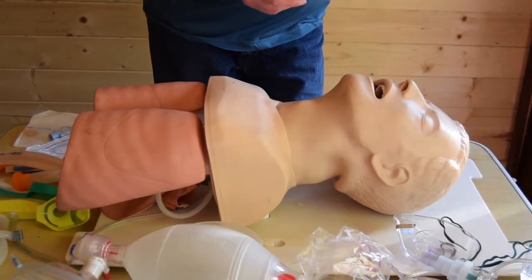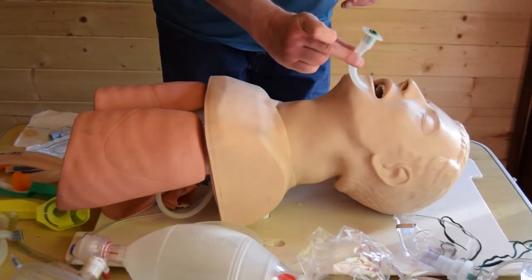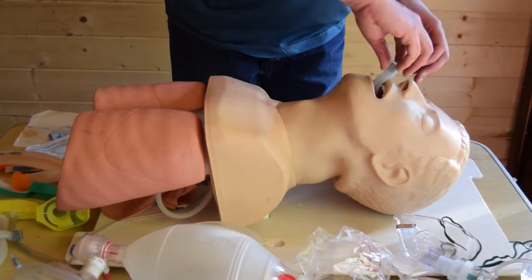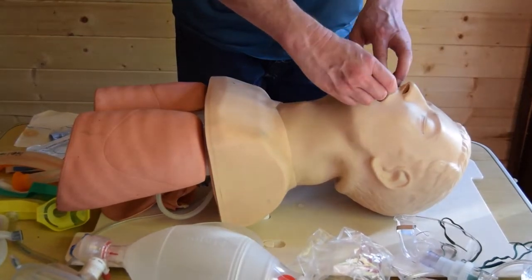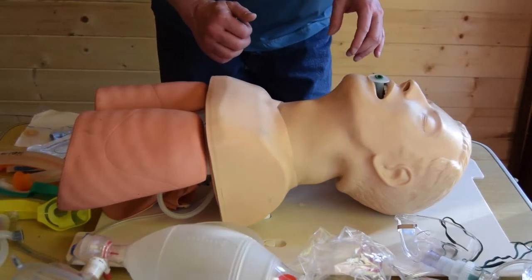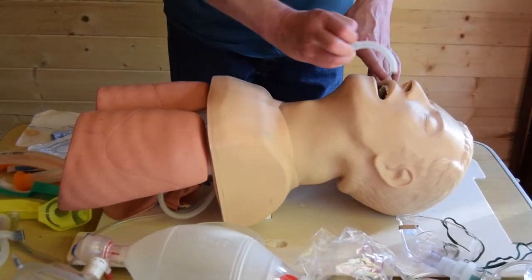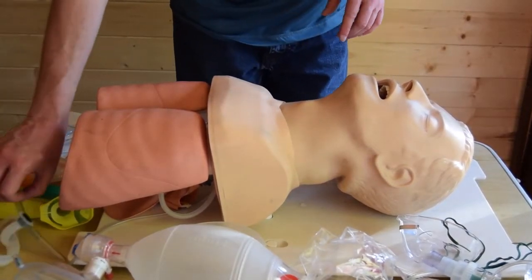To insert the oropharyngeal airway, we always insert it upside down, as illustrated. We'll pop it into the mouth, rotate it, and then locate it. It will sit just on the incisors and provide a nice clear airway down the back of the throat. So that's the oropharyngeal airway, or OPA. So we have some different types of airways.